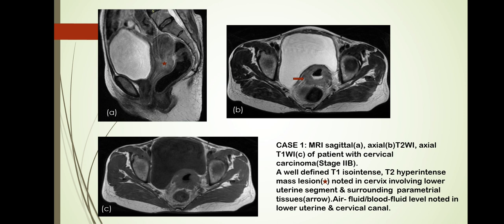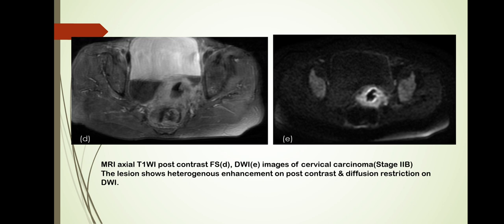These are the images of the first case, presented with cervical carcinoma staged at stage 2B. Images A and B are the sagittal and axial sections of T2-weighted images, and C is the axial section of the T1-weighted image, showing a well-defined T1 iso-intense, T2 hyper-intense mass lesion (marked with an asterisk) noted in the cervix involving the lower uterine segment and surrounding parametrial tissues (shown by arrow). Air-fluid or blood-fluid levels are noted in the lower uterine and cervical canal. T1-weighted post-contrast and diffusion-weighted images (D and E) show heterogeneous enhancement on post-contrast and diffusion restriction on DWI.